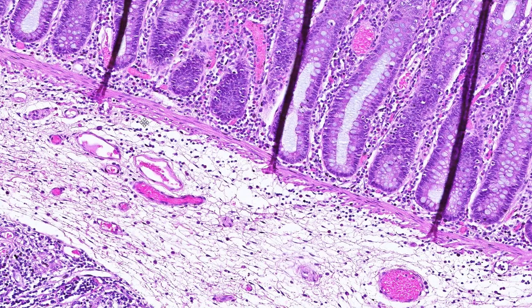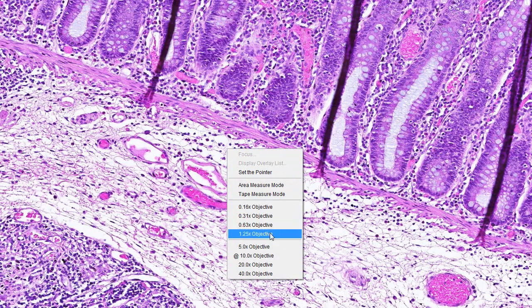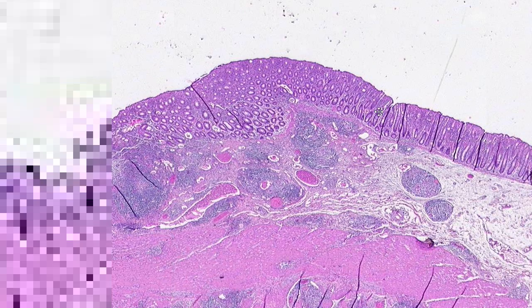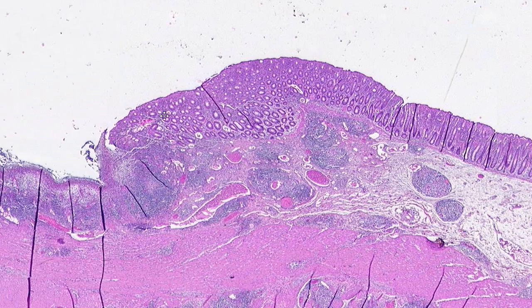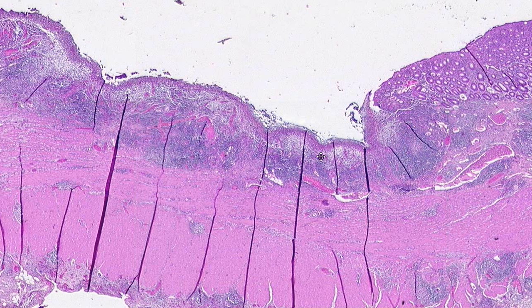We have the muscularis mucosa. These are artifactual folds in the slide, so don't get confused by those. Now if we come along the mucosa, we see that we get to a region where the mucosa is missing.